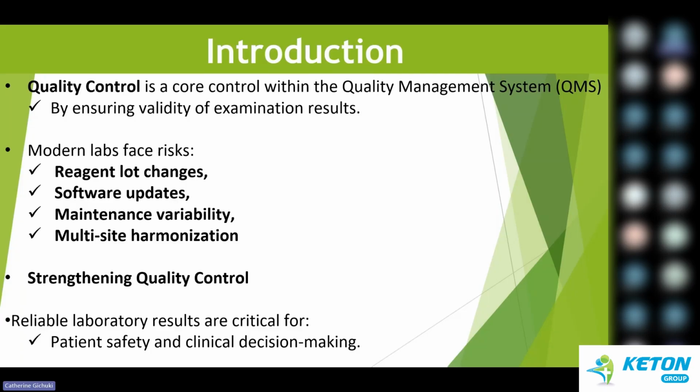By doing this, we are able to gain reliable lab results, which are critical in decision making during a patient's journey. Because our role as lab techs, as medical lab technologists, is to aid in clinical diagnosis and clinical decision making. So if we're able to produce reliable results, then of course we have checked the patient safety.